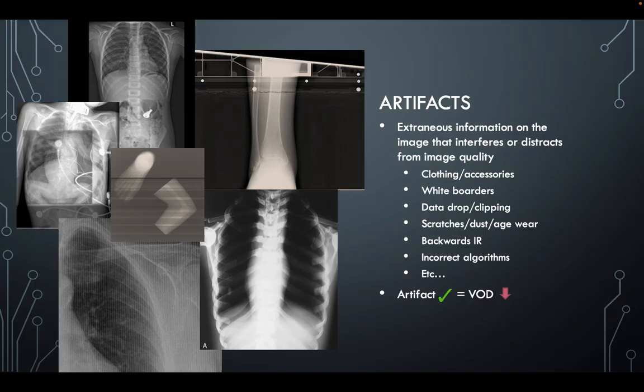And so this is really concerning. We want to make sure that data drop, data clipping doesn't happen. So especially when you have overexposed images, make sure you're really paying attention and you don't see any data clipping or data drop.